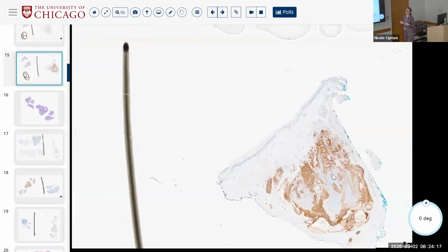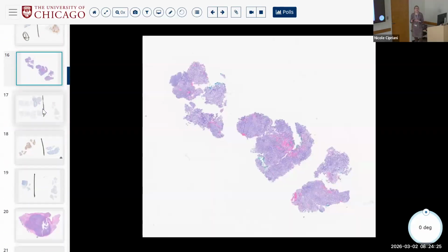If you're looking at mesenchymal cells, like myxoid, yeah, you can always think about something mesenchymal as your myxoid myoepithelial cells, but usually you'll have something like S100, SOX10, P63, or P40 that will direct you that these are probably just myoepithelial cells rather than mesenchymal cells, because myoepithelial cells can be spindled, and we'll see that later.